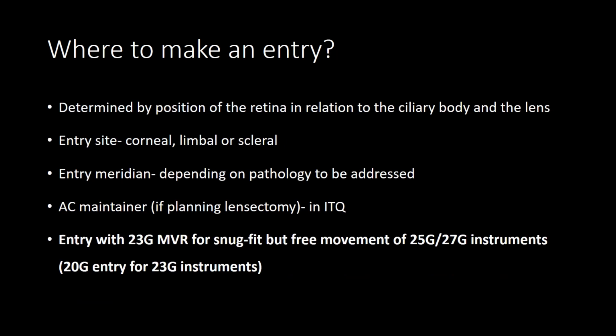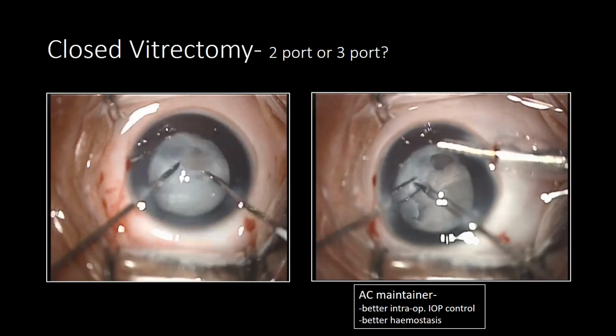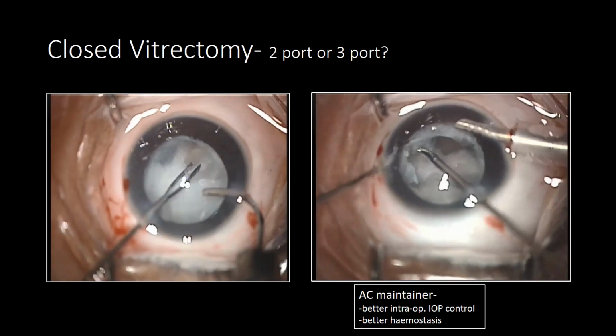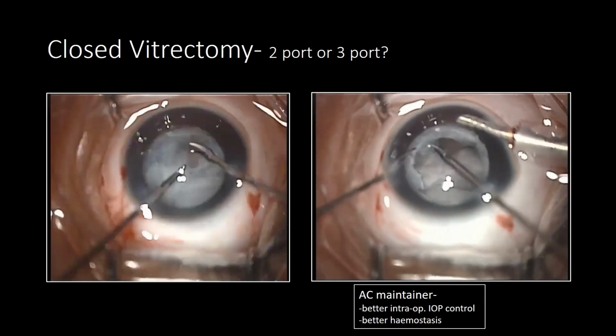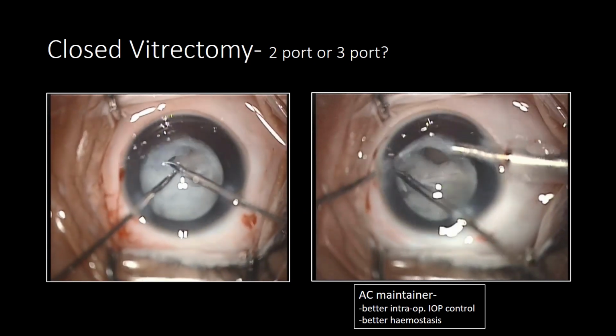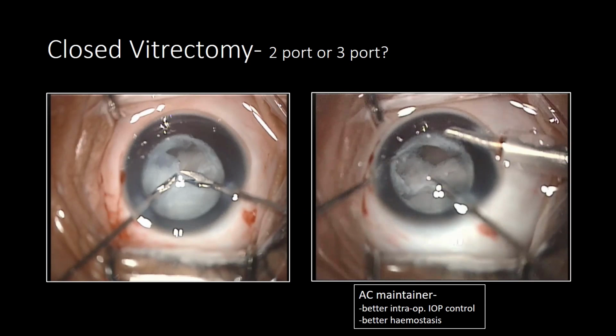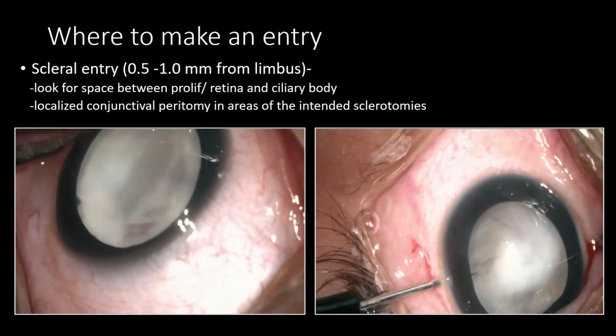Okay. So again, as I said, determine position, the same thing. So entry can be either corneal, limbal, or scleral. You can use a 2-port or 3-port. Here just 2-port and use a visco intermittently to maintain the eyeball IOP, as against using an AC maintainer. Again, that helps you to better IOP control and better hemostasis throughout the surgery. Because with visco, when you inject, partly it keeps on coming out, and again you have to stop surgery and keep on injecting.